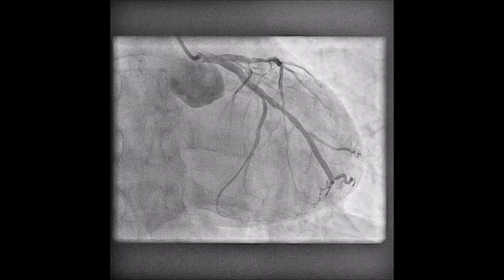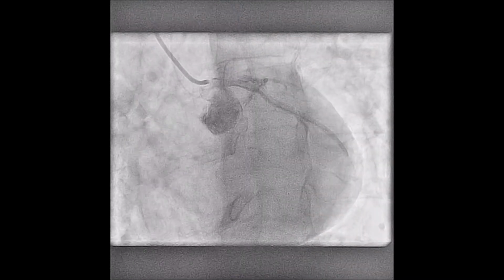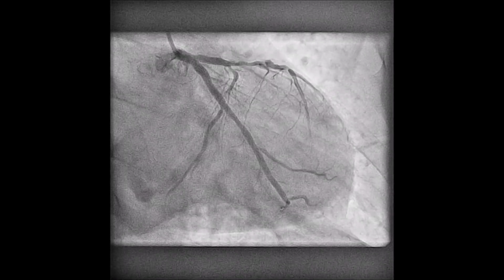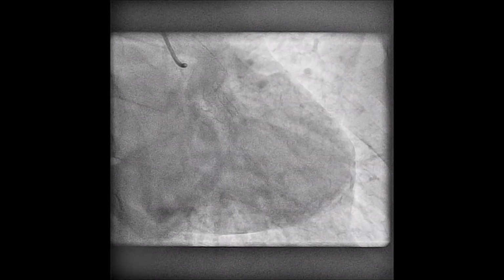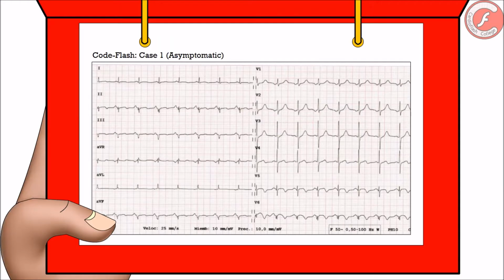And this is the final result. As you can see, we have recovered the blood flow of the artery after implanting the stent, obtaining a good angiographic outcome and without pre-procedure complications. In this way, with the artery open, the ST alterations are progressively improving and pain disappears, being this emergency resolved, and with it, our chapter.